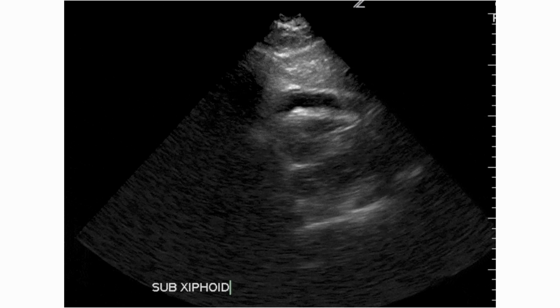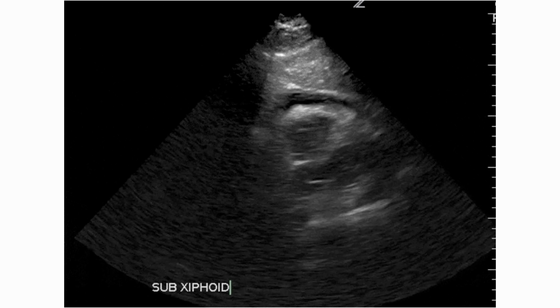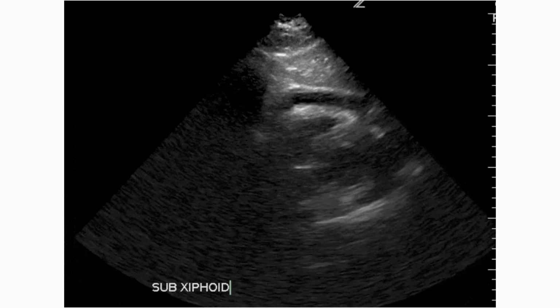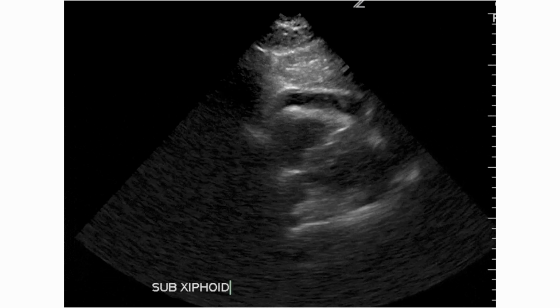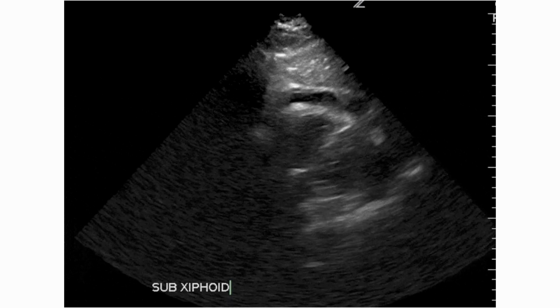Here's a subxiphoid view. So we're looking at the heart. Remember that first structure we're seeing is the RV. And right on the outside of the RV, between it and the pericardium, is a collection of black anechoic density that's concerning for a pericardial effusion.